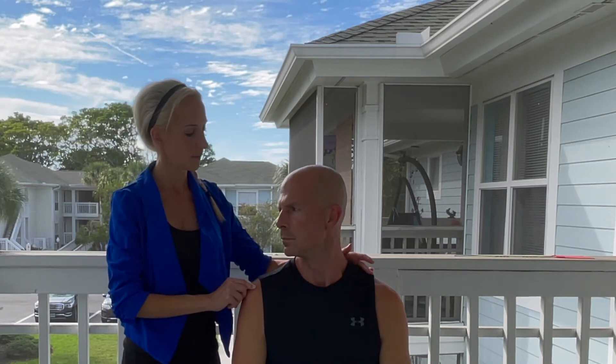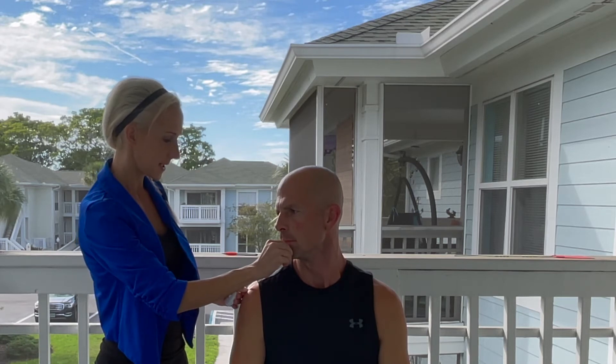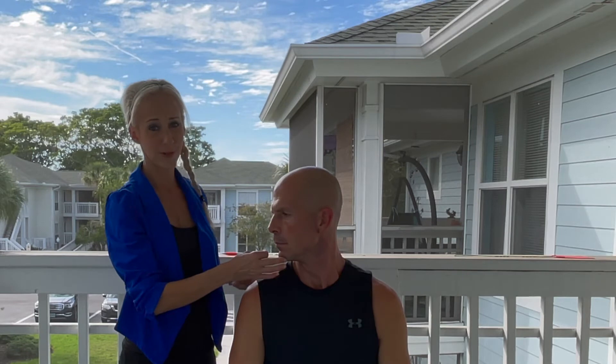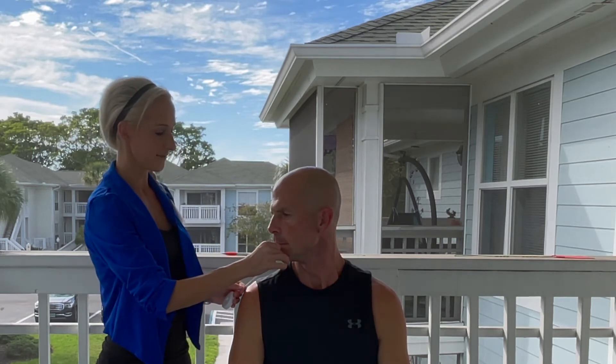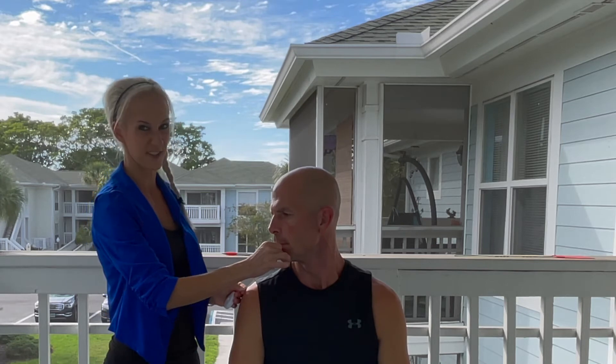Cory, rotate your head this way — perfect, stay right there. We measure from the chin to the lateral tip of the AC joint in centimeters. I have 16. I can even do passive here a little bit more, and you'll probably have to let go for an accurate measure — I've got about another half centimeter. Bring it back to center.